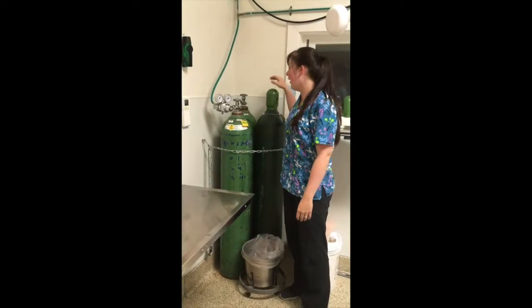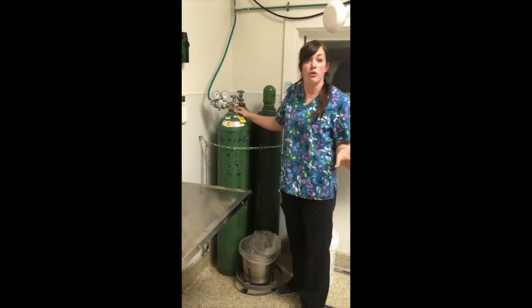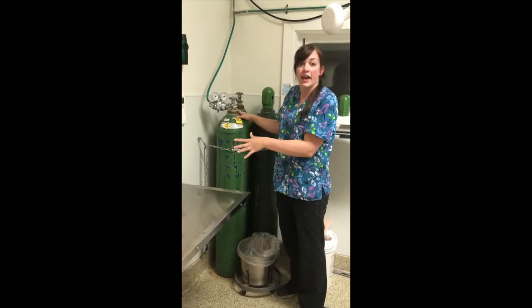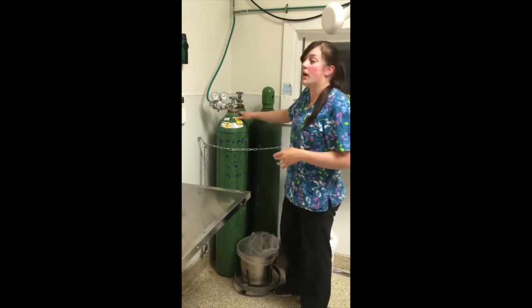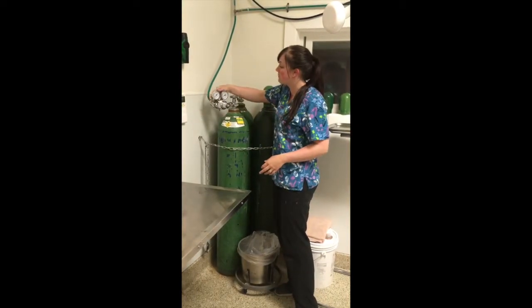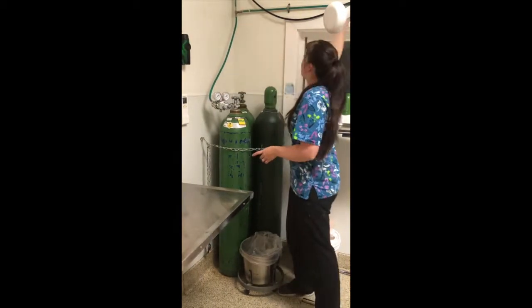Alright, so this is where our oxygen supply comes from. Our surgery suites have their own oxygen generators, but for our treatment area oxygen and emergency cart oxygen, they come from these lines. So we have tanks that are hooked to pressure meters, and then the lines run up and through to the different rooms.